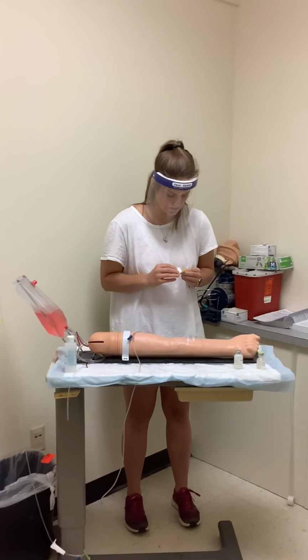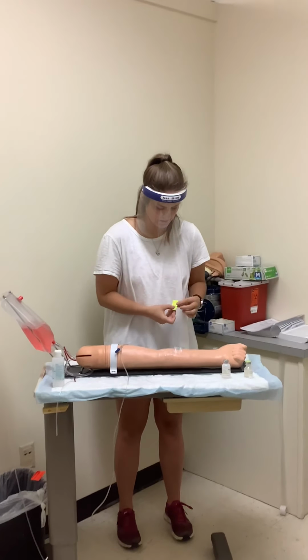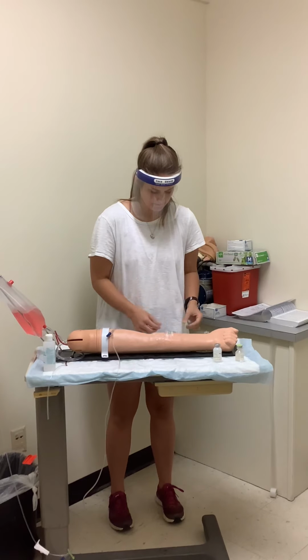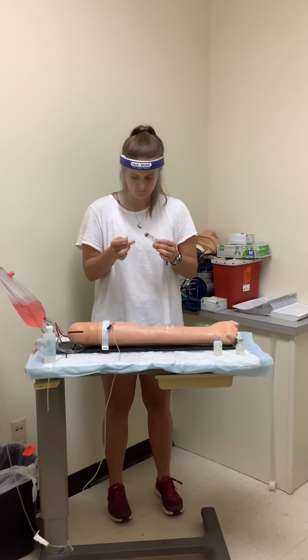So I can then label the syringe, and I can draw up my medication.